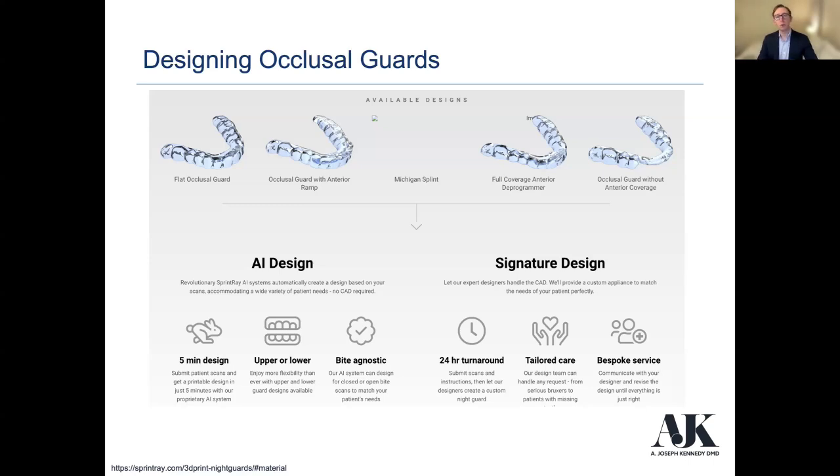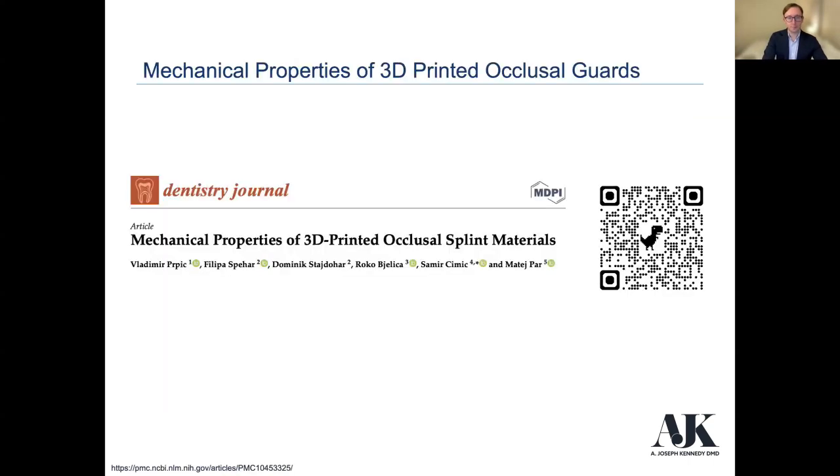So again, as I mentioned before, do you want to design it yourself through one of these softwares? Do you want to have AI design it through some of the software that's built in? Do you want to have a lab technician design it and send it back to you, or have them print it at their lab and just send you the final? So a lot of different ways to do these things.